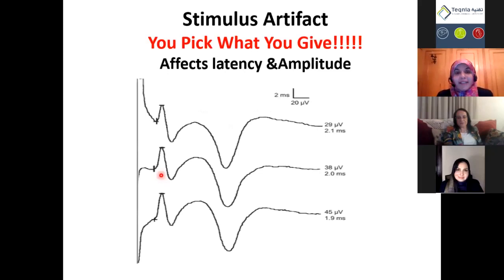The stimulus artifact. It's one of the huge, major problems that we see in electrodiagnostic studies. You give the patient a stimulus, and you pick it up. What is the problem when I pick up this stimulus? It's not just that I want a good morphology for the response, I want an accurate reading. The artifact will affect the amplitude, and the latency is not the same. So eliminating stimulus artifact reduces the error in the latency and amplitude calculation.